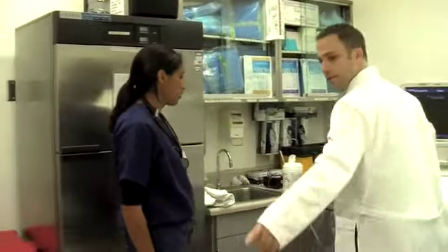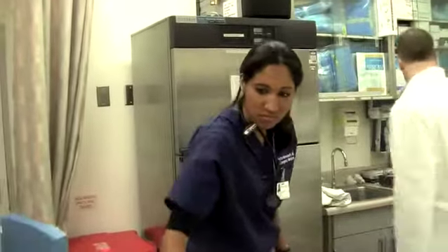Okay, so that takes care of how to clean the machine, and the machine is now ready for use. One final point, and this is a very, very important point, because again, these probes are very expensive, and we have to be very careful with them. There's only two places where this probe should be. It's in your hand or in the stand.